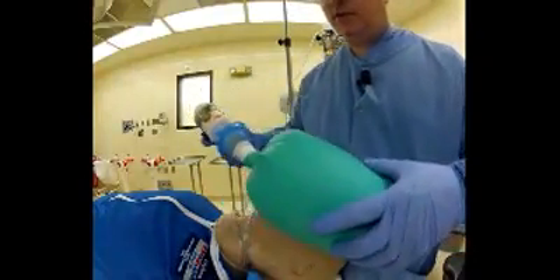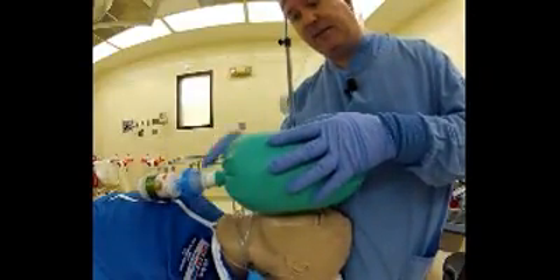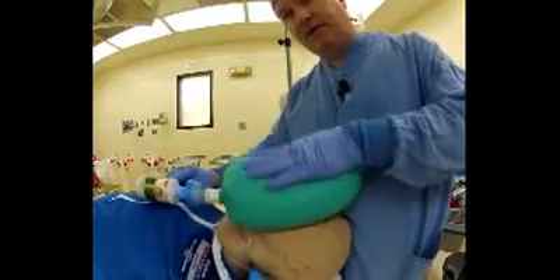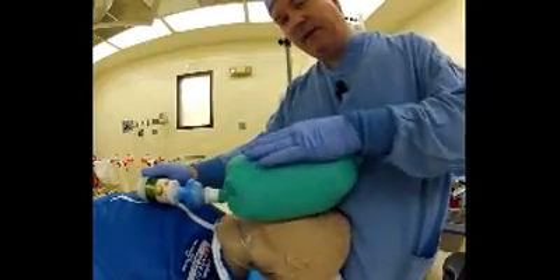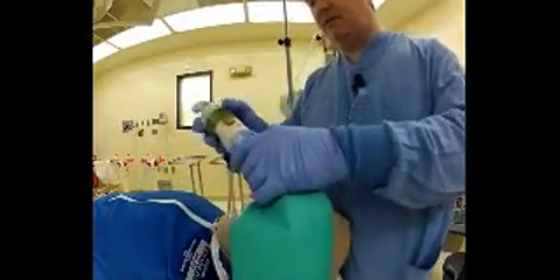Let's do a quick demonstration of CPR on this bag. You're going to notice that the valve on this device is fast enough to literally trigger in between chest compressions. You'll see this on the mannequin as well.